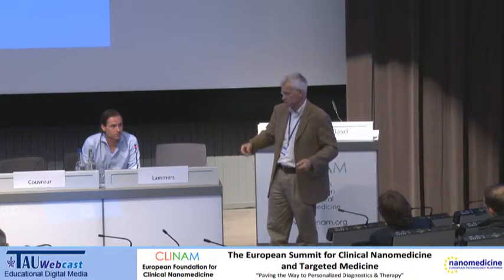MRI allows you to look at extravasation. You can do this procedure without the drug, looking at the extravasation of MR contrast agent. And there are really good studies that have looked at the closure of the temporal window, and it's of the order of hours to a day, depending on how big the drug is. That is work by Benoît Lara and others in Paris. But in principle, you're right. You can expect toxicity because of that breakage and extravasation of other compounds.